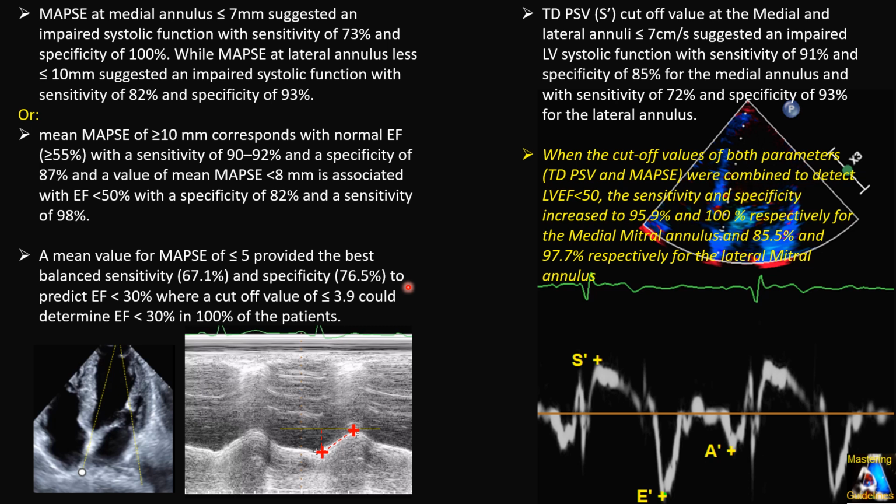In those cases that you don't have a very clear endocardium and you want to correspond your eyeball guessing with a measurable ejection fraction, and you don't have access to Definity, or it's not an indication for sending the patient to MRI and all those things.